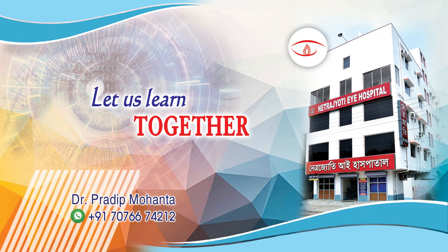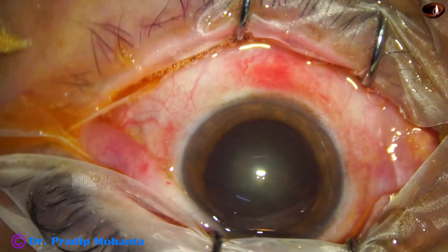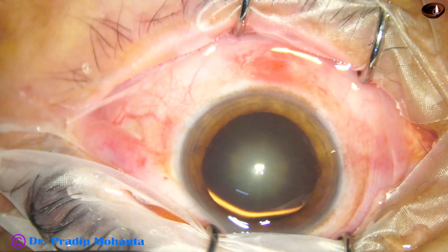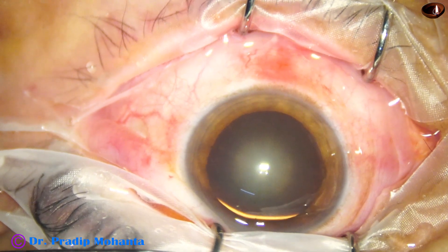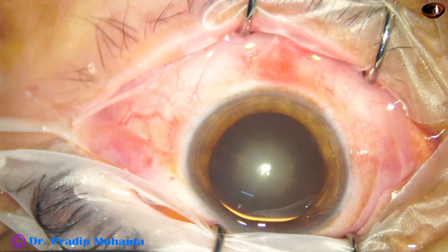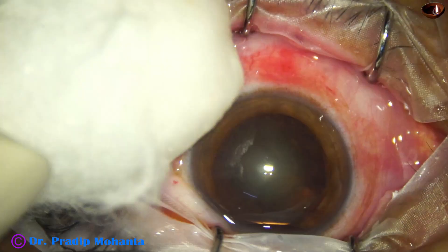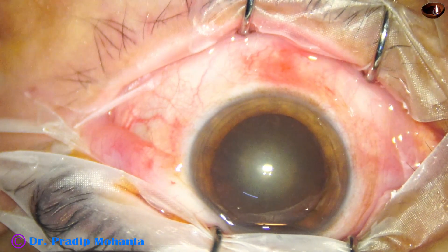Friends, welcome to my workplace at Ranakh Heart, West Bengal, India. Through this video we will see hydrodissection, hydrodelineation, removal of cortex by the handpiece itself, and hydro implantation of the intraocular lens. This is a totally unedited surgery.